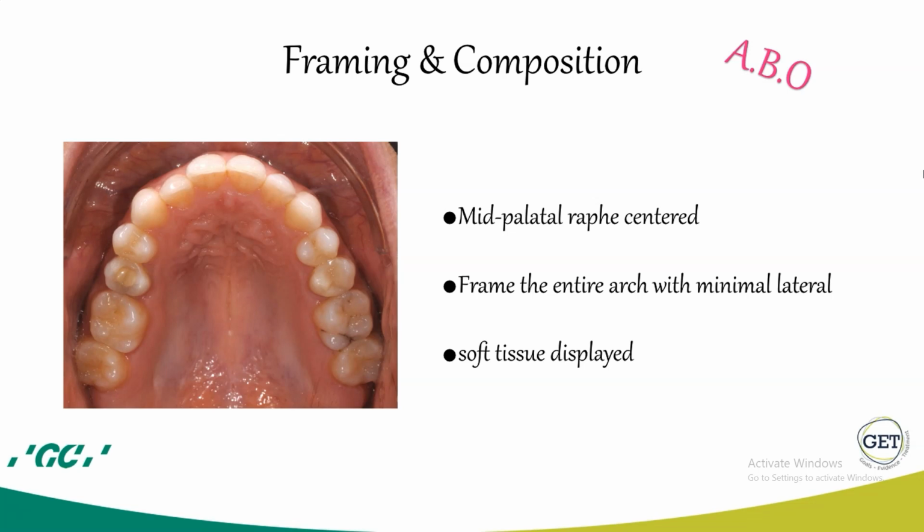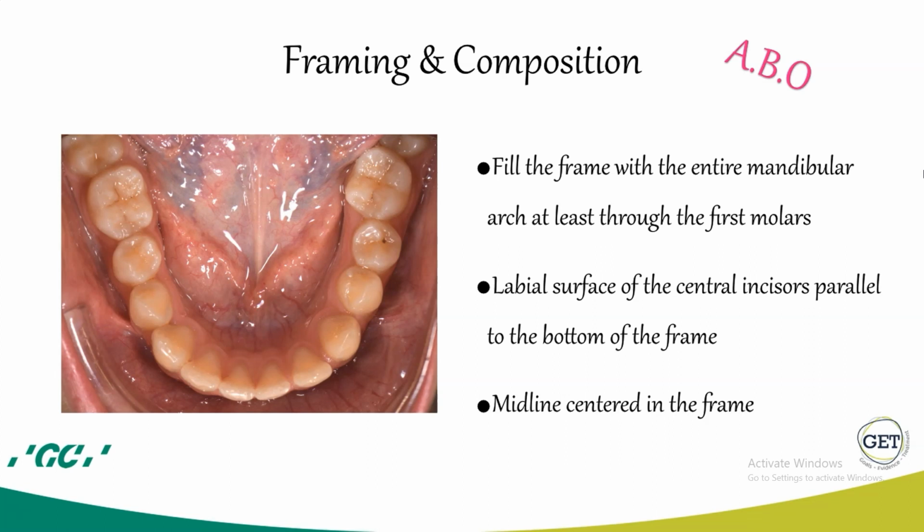We should retract all the soft tissue as much as possible. We should fill the frame with the entire mandibular arch, at least through the first molars. The labial surface of the central incisors should be parallel to the bottom of the frame, and the midline should be centered in the frame.